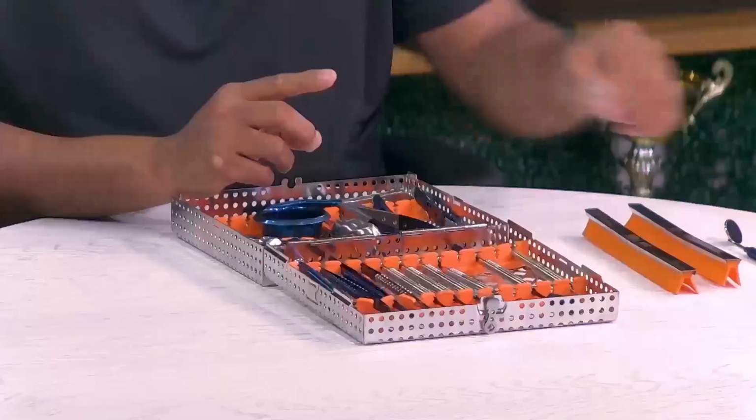The second aspect of it, we're using this as a bone plugger as well, especially when we're trying to fill the apical areas of our sockets and get good apical fill with our bone granules. We're using this to help pack that area down, because it really does get down 10, 12, 15 millimeters into the socket and does a good job of packing everything in there. So we have a probe explorer. The probe end is used mainly for implant osteotomy feel and also to help do some grafting as well.